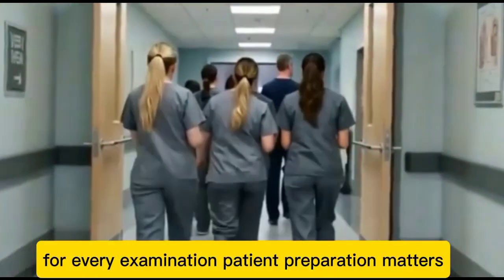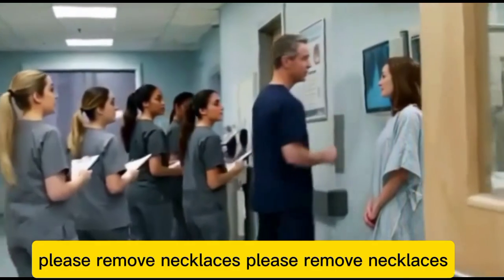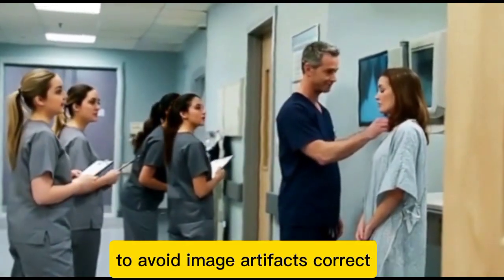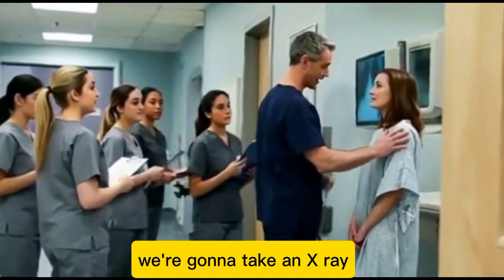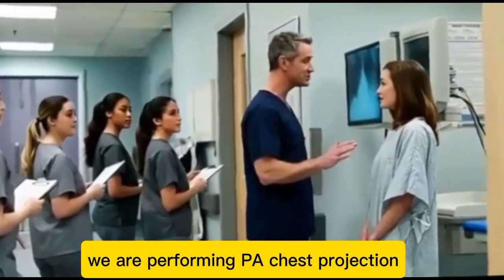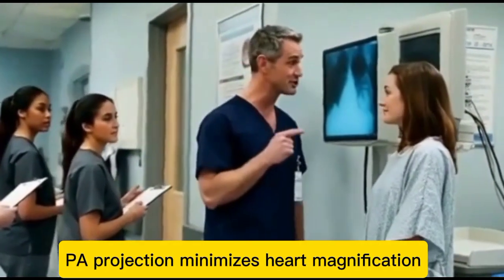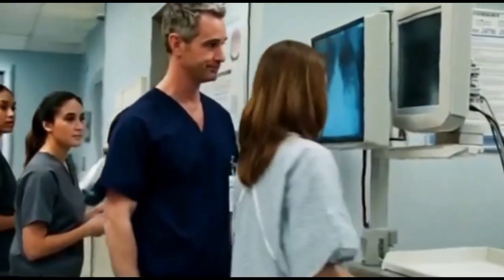For every examination, patient preparation matters. Please remove necklaces, metallic objects, and clothing artifacts to avoid image artifacts. Correct. Always confirm identity and explain. We're going to take an x-ray. I'll explain the procedure. Okay, is it safe? Yes. We are performing a PA chest projection. Why PA instead of AP? Excellent question. PA projection minimizes heart magnification because the heart lies closer to the image receptor.